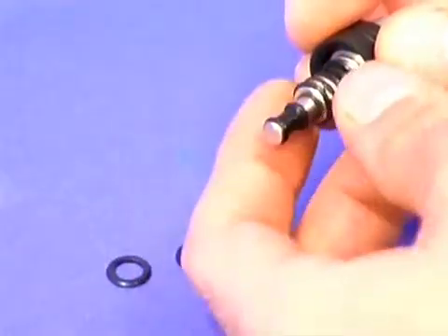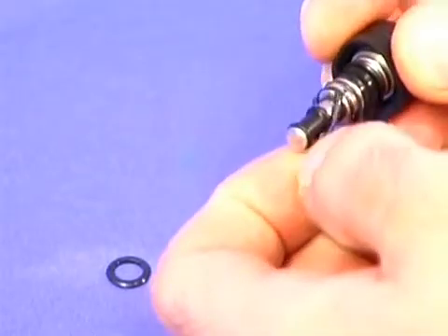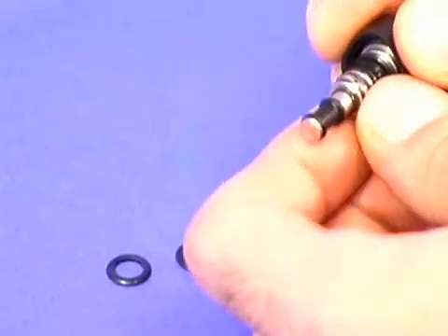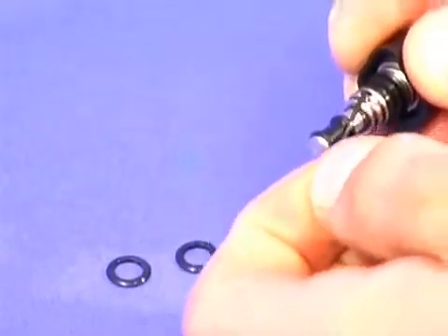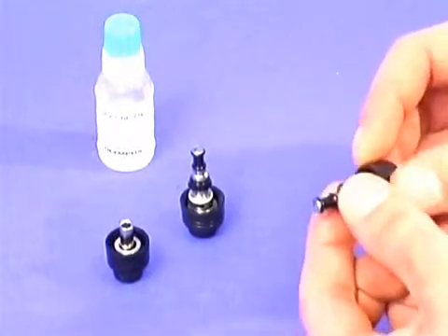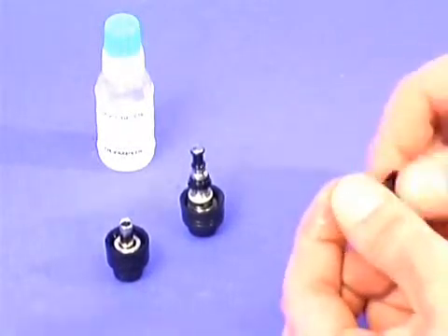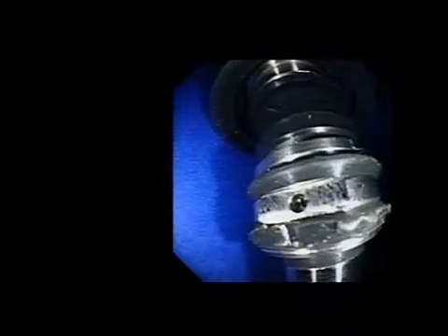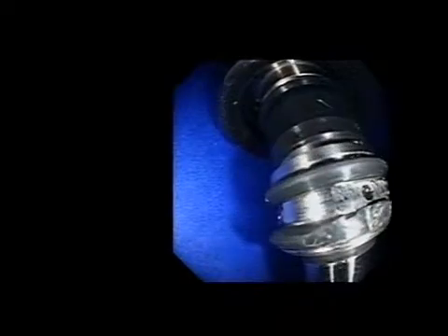Because the mechanism of the CO2 valve is complex, the two rubber O-rings on it have to be made thinner, so more delicate than those on the air valve. So the CO2 valve O-rings need to be carefully checked for damage or stretching after cleaning and disinfection, and quite frequently need to be replaced with new ones to ensure proper functioning.